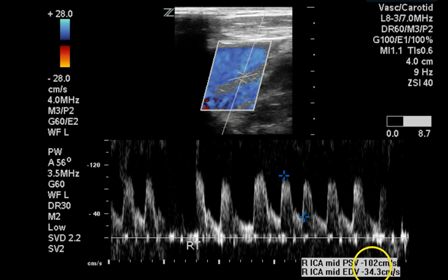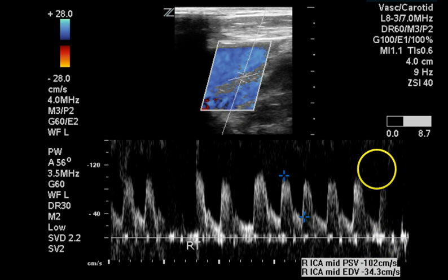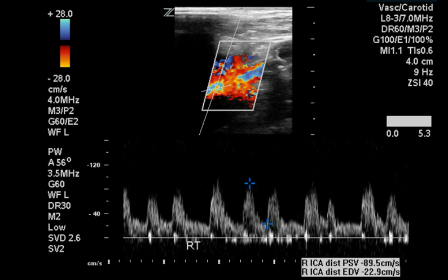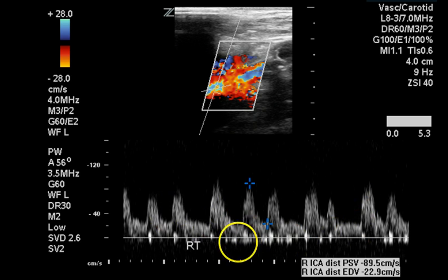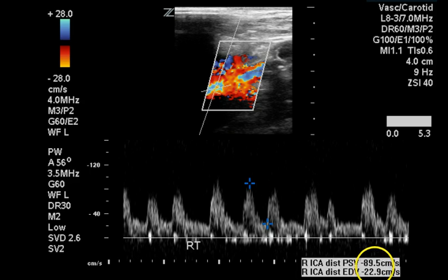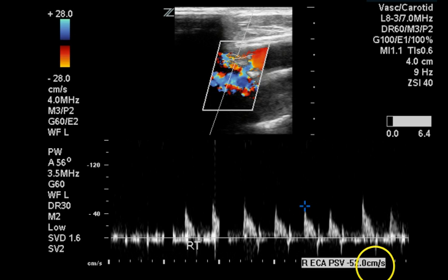This shows a normal velocity of 102 centimeters per second peak systolic and 34 centimeters per second end diastolic. The distal internal carotid artery appears normal as well. Again, there appears to be an arrhythmia on top of the tachycardia, with normal velocities.